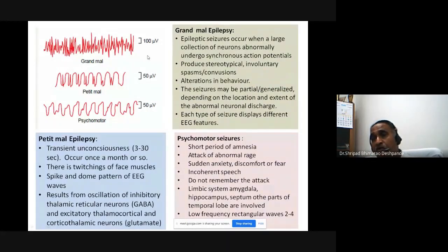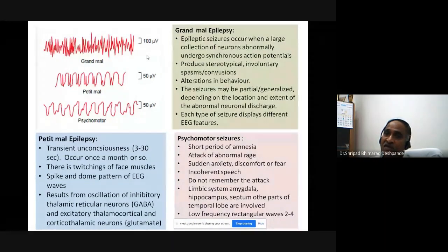However, when he is not having convulsions, he may have a normal EEG, because this pattern is seen only when he has an attack. We don't know when he will get an attack. With a hospitalized patient it is difficult to wait for convulsions.